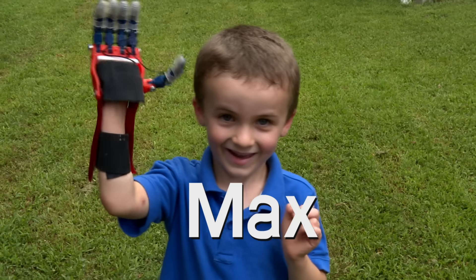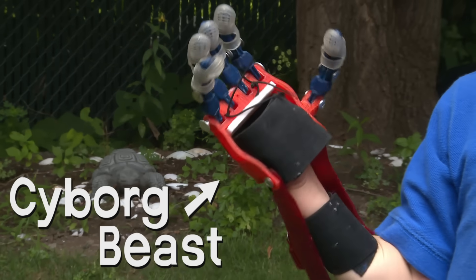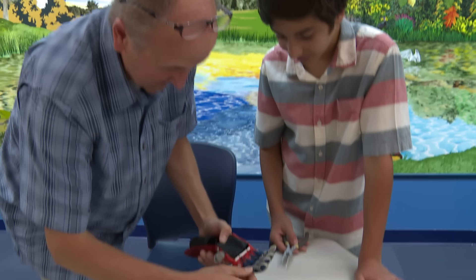Hi, I'm Max, and this is the Cyborg Beast. Hi, I'm Wes. I help my teacher Mr. Lair build the Cyborg Beast. Mr. Lair is Max's dad.